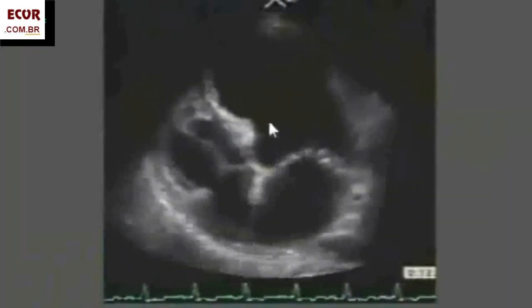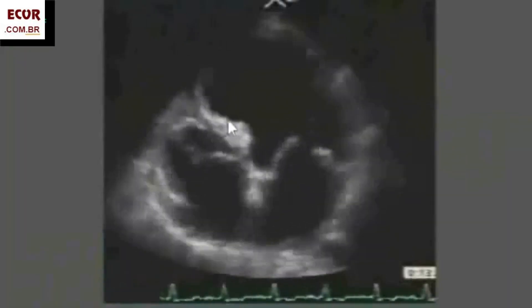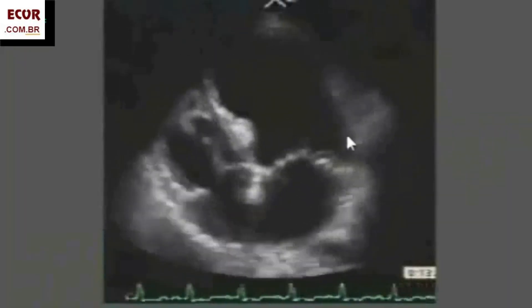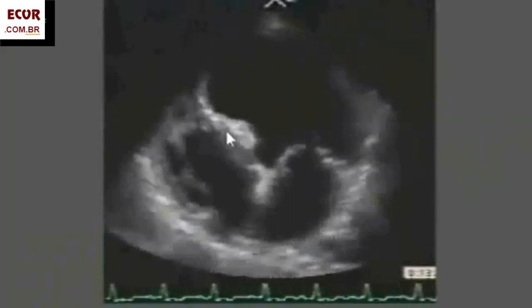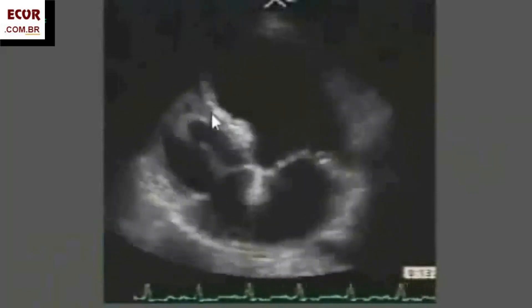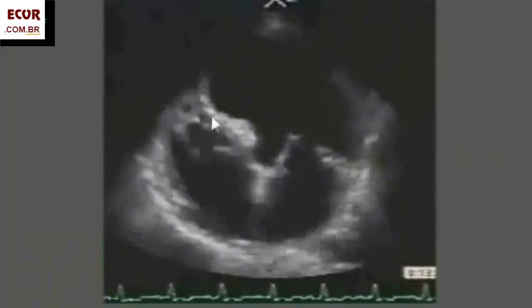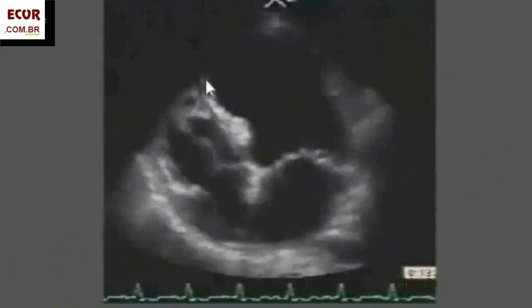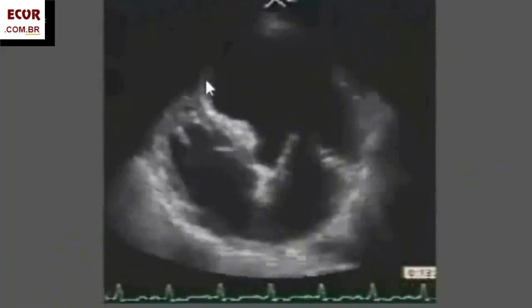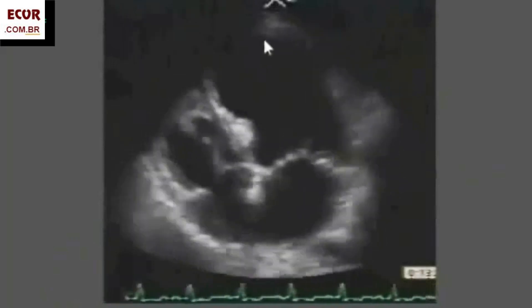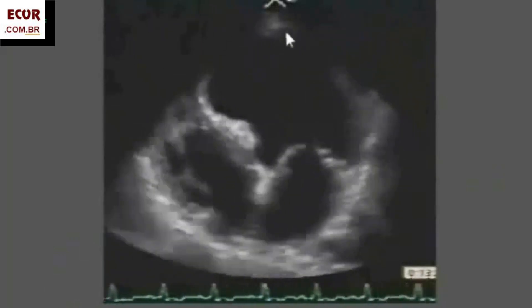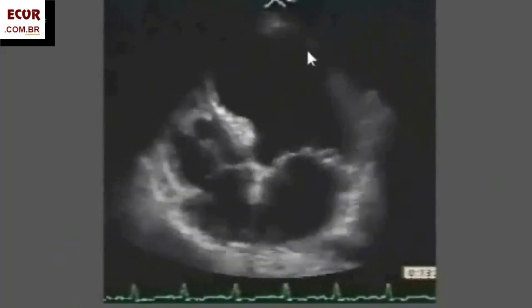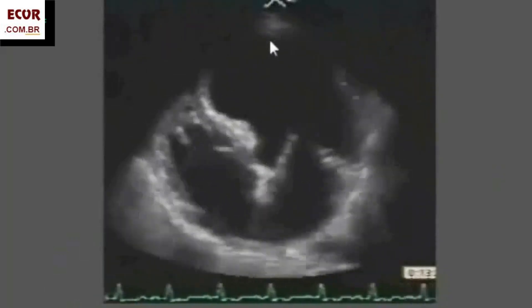Here is a really big aneurysm — it involves more than two-thirds of the left ventricle. We see the beginning of the neck here. The wall gets thinner. It is dyskinetic during systole. It's really big.